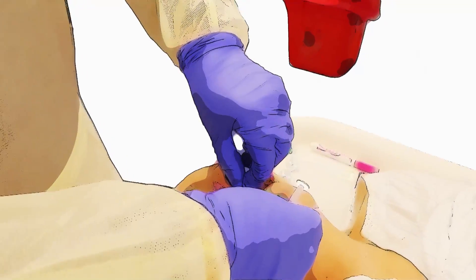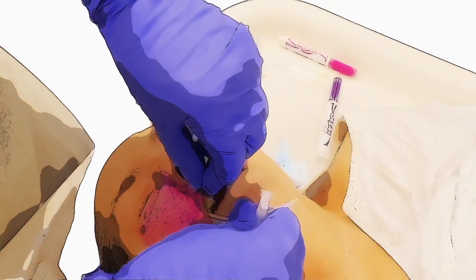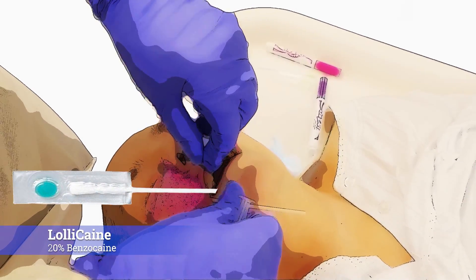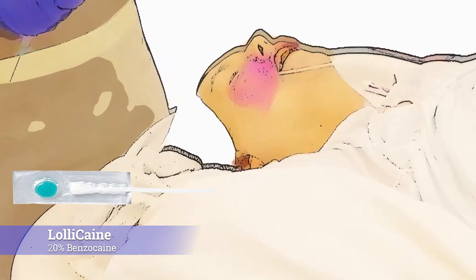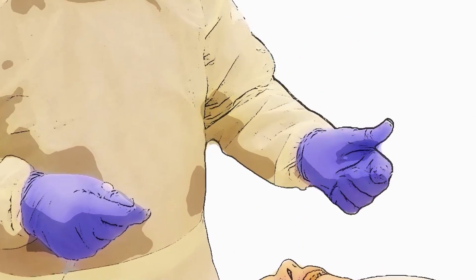It's going to go up under the lip. I'm going to put this at the second bicuspid. This 20% benzocaine is going to provide some anesthesia, and we're at the second bicuspid.